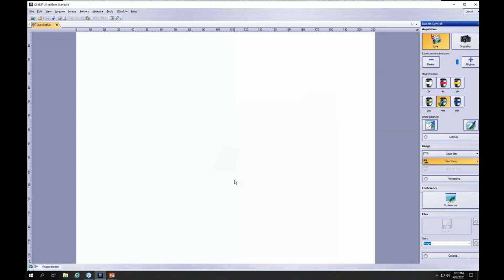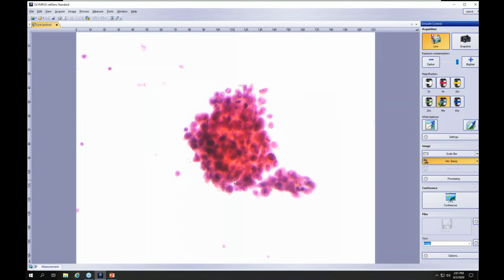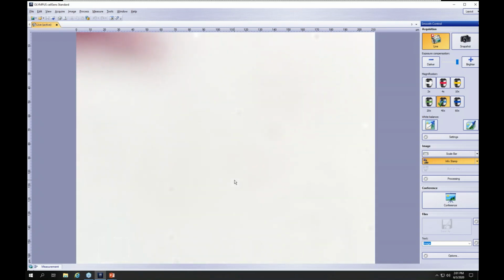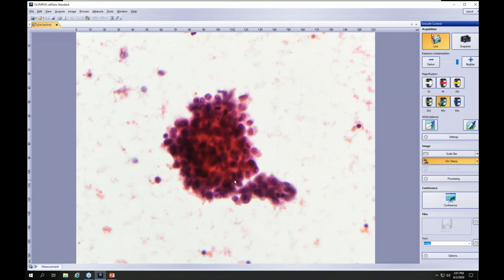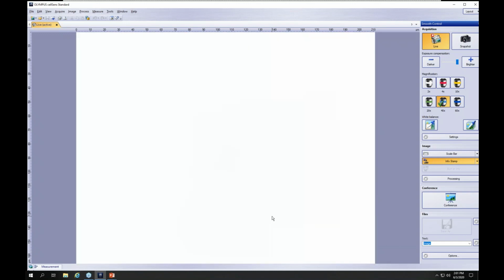And then right next door, we were seeing these clusters of cells that, you know, we were thinking, this is a tough case. Are these just mesothelial cells, or is this something worse? Because look at this prominent nucleoli and increased nuclear to cytoplasmic ratio. I think everybody has these cases sometimes that we're just not sure of.